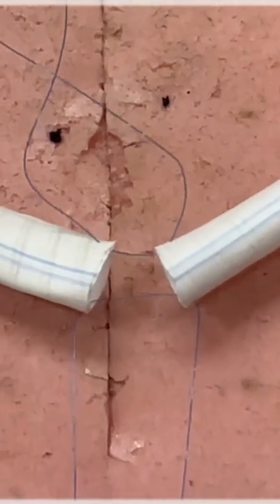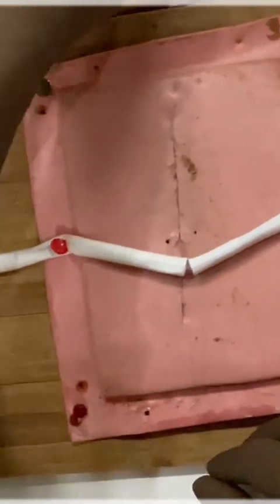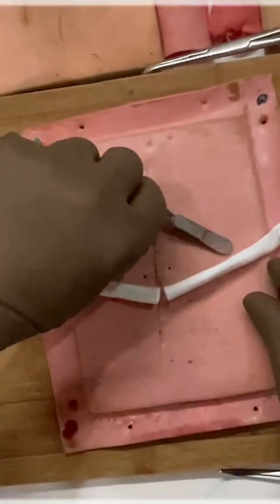Otherwise, in a real-life scenario, it always has to be a double arm suture, and you will always come inside out on both ends. And so I have taken this 6 o'clock suture. Again, I am not applying knots here, and I will keep it as such so that they remain aligned. The blue line, as you can assume, is the marking.